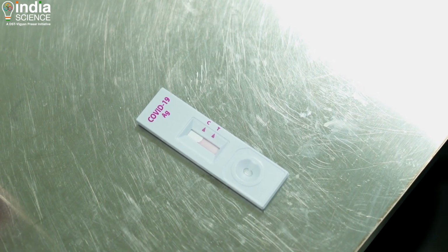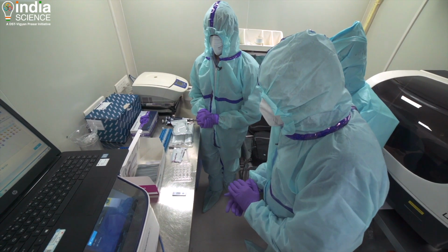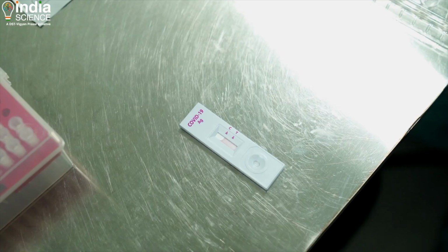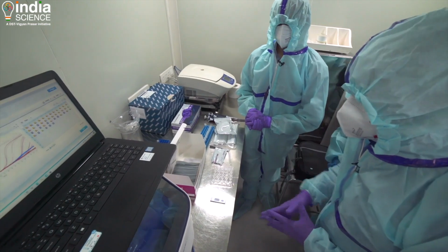So this is the antigen. The AG stands for antigen. So you are detecting the viral protein here. And this also actually shows whether you are infected or not. Yes. So we are waiting. The whole strip will become pink. It will go right to the top.